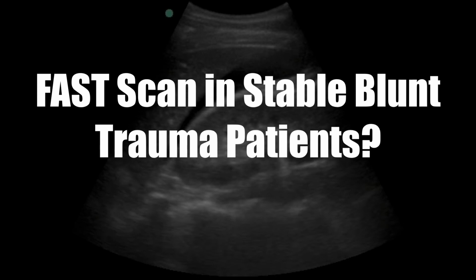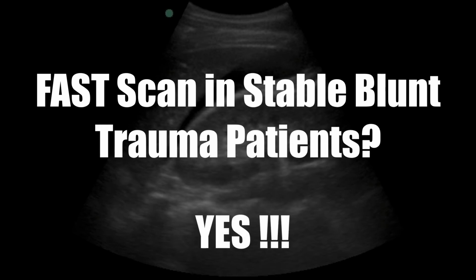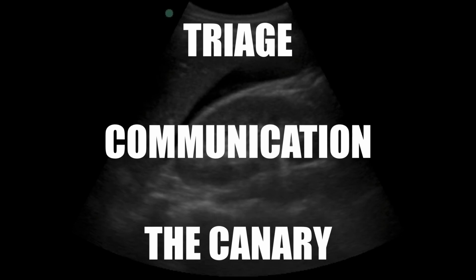So if we go back to the beginning and ask ourselves, is there a role for the FAST scan in assessing stable patients with blunt trauma? I say absolutely yes. It allows us to triage, something that you can all do on your next busy emergency department shift in prioritising your trauma patients for advanced imaging, or that you might need to use at a mass casualty scene in the pre-hospital setting.